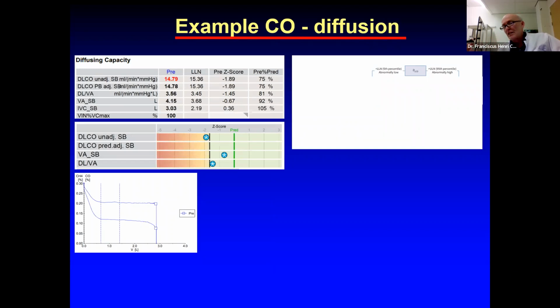Each year in my lab, I would say at least 10 patients come with a lot of dyspnea complaints. The only thing you find is totally normal lung function and lung volumes, but their DLCO is very much impaired because they do not have enough hemoglobin. They have an anemia which causes these dyspnea complaints.